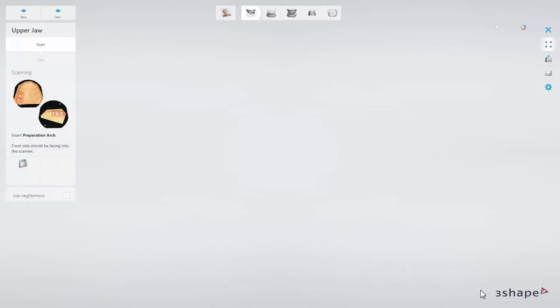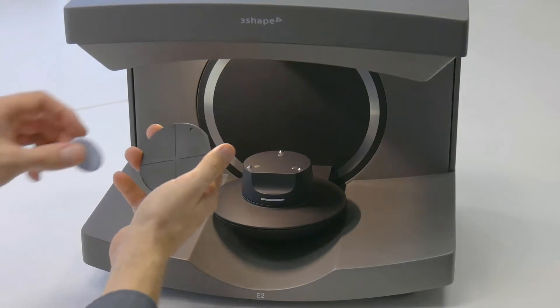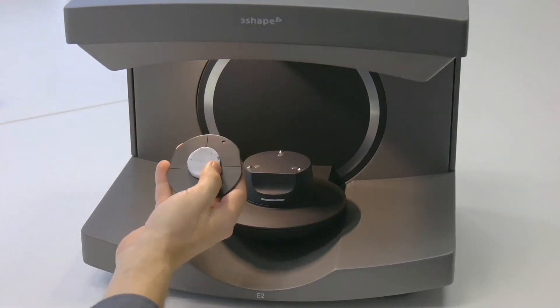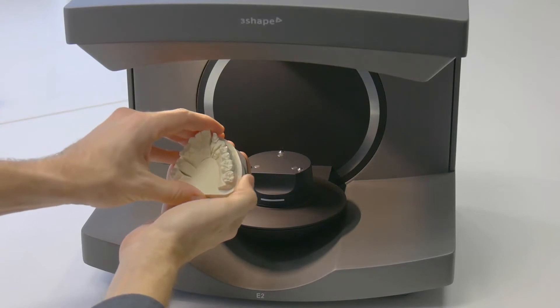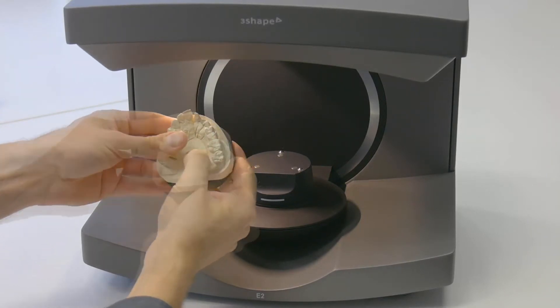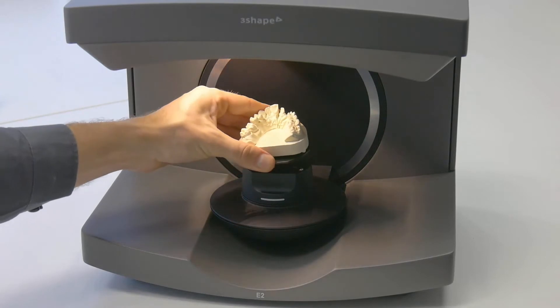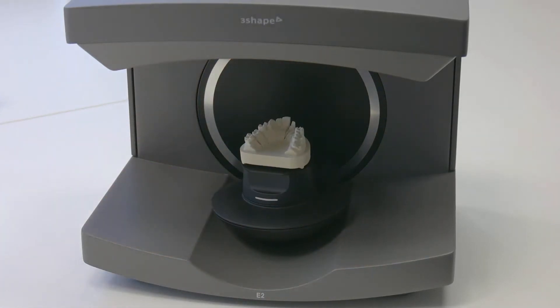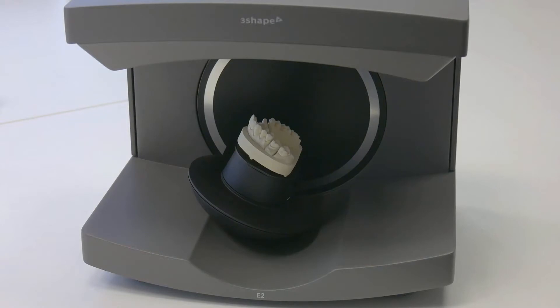The message 'Insert the Preparation Arch' will appear in the Scanit Dental window. Please place the correct model, affixed with BluTac, onto one of the plates which were packaged with the scanner, then insert it into the scanner. Remember that it is not necessary to click Next if you have enabled the Auto Start option in the settings — in that case, the scanner will start scanning automatically.